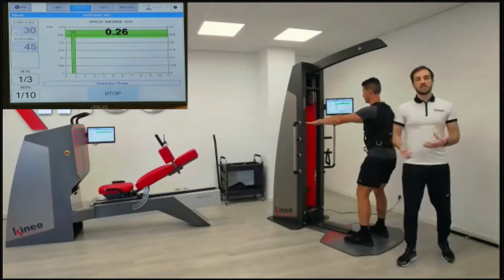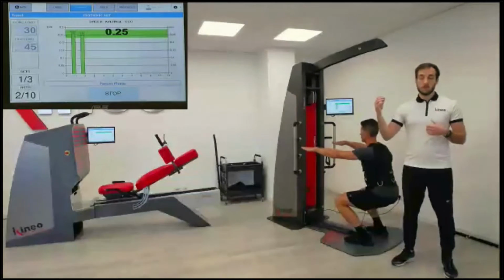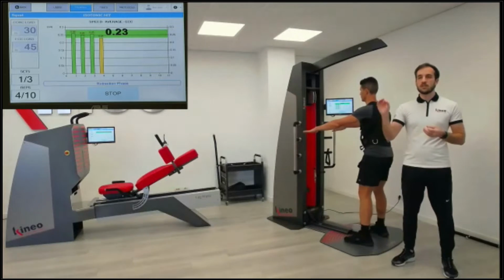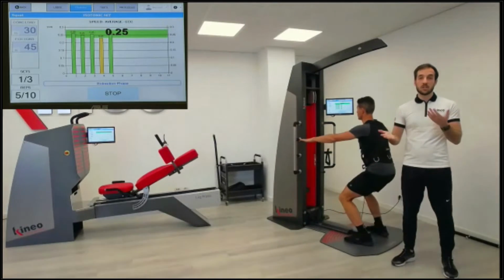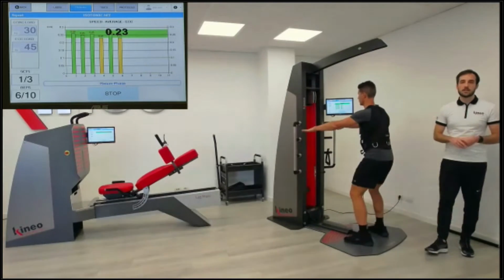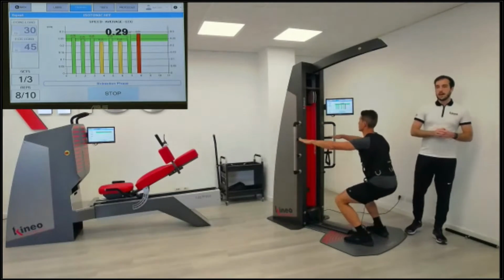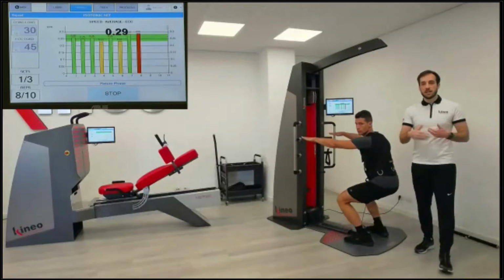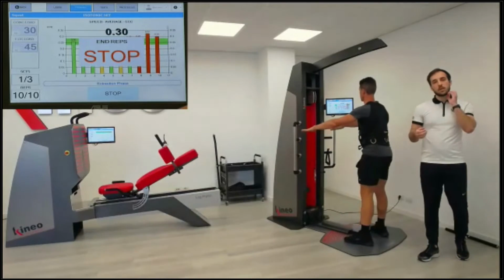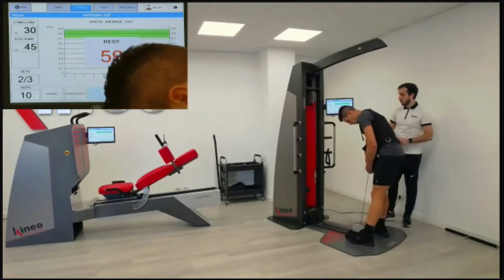And those are just examples. So you can manage the load, and in the webinar that we will do on eccentric training methodology, we will definitely go into the detail on how to manage concentric and eccentric loading in the proper way. This is just an example, so don't take for granted that 30 and 45 kilograms are the ratio, because either Damiano is already trained with the Kineo, and as well, different people have different capacity. Okay, so thank you. You can take off.